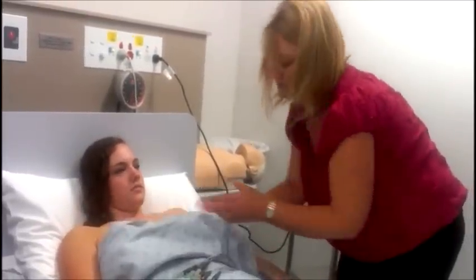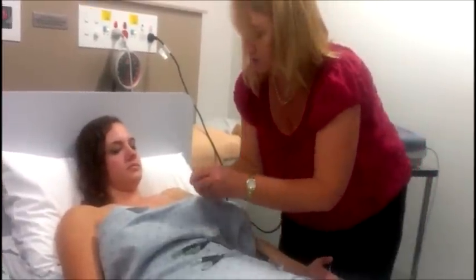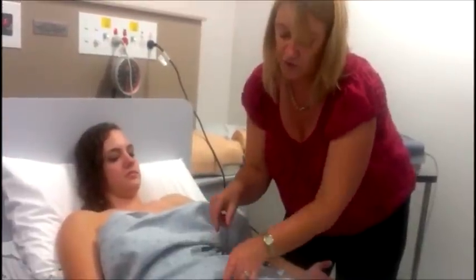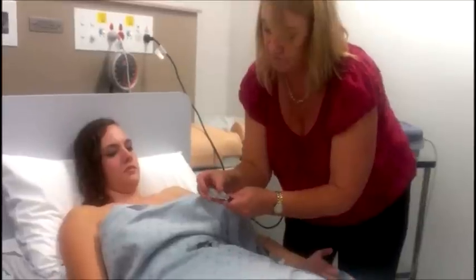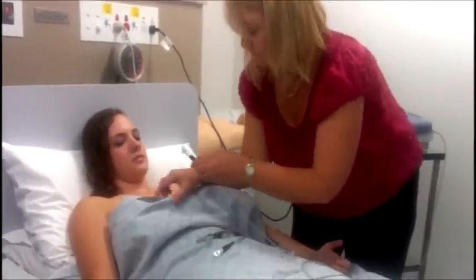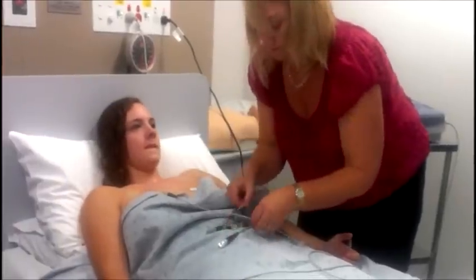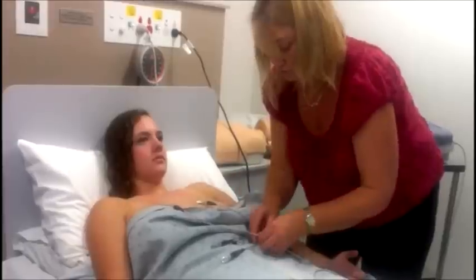When you're doing the chest leads, only expose the patient for as little time as possible. The leads are numbered — do those three together and then those three together.